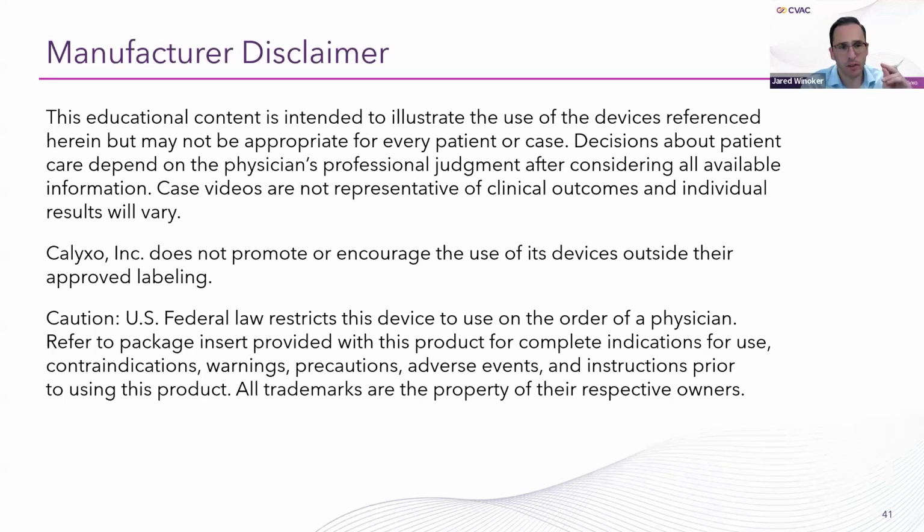Yeah, I find the hydrophilic coating on the device to actually be a little more slippery than some of the access sheaths, frankly. And of course, I'm sure you do it also, anytime I'm putting up without a sheath, that's including the included internal stylet over the wire to make sure that you have a tapering at the tip.